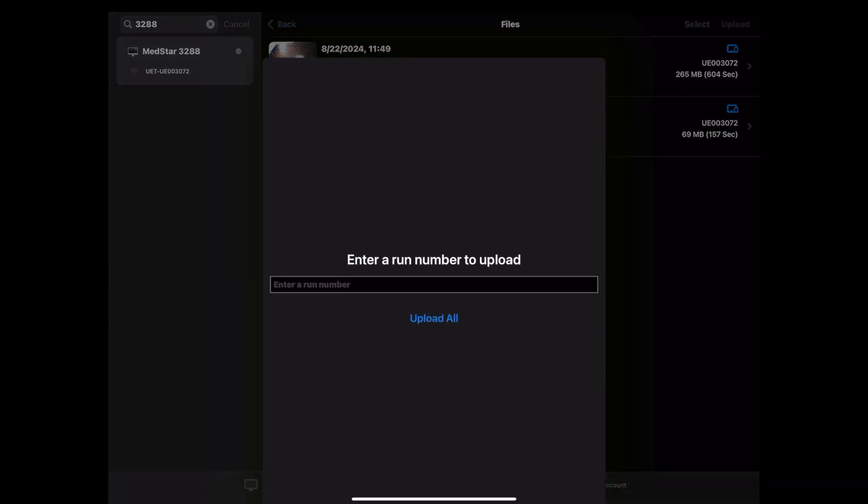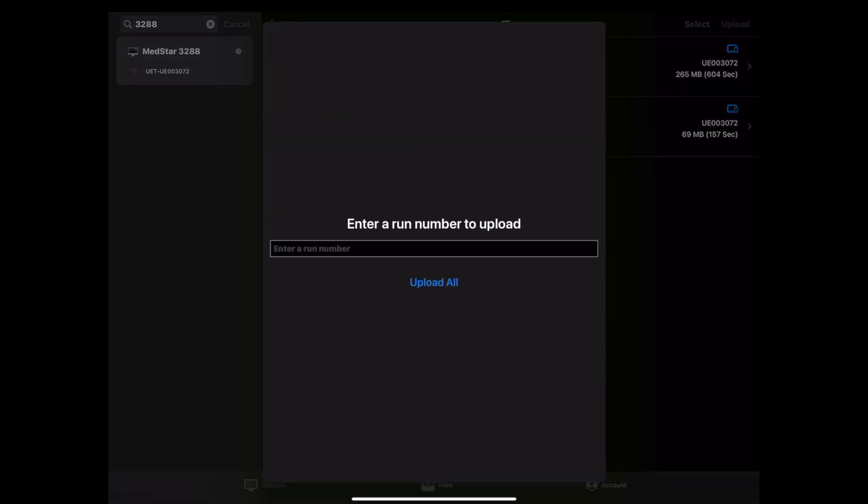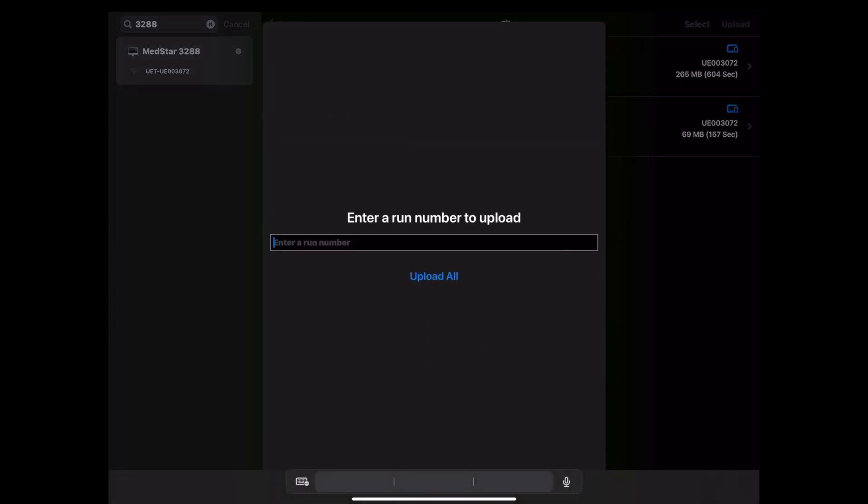After clicking either of these buttons, you will then be prompted to enter a run number. What you are entering here should typically be the MedStar response number. It is not acceptable to leave this section blank. This is almost the only way we will be able to associate the video with your intubation case.